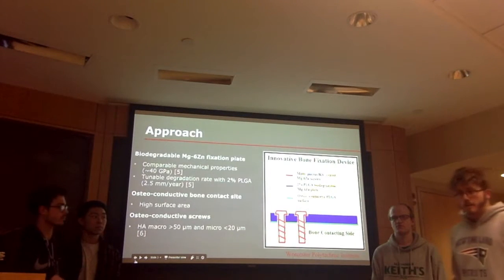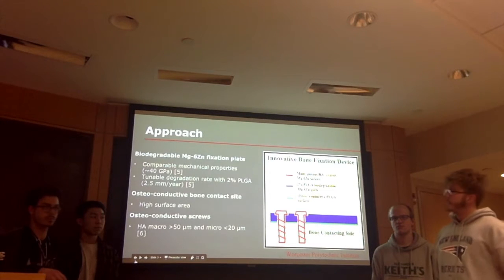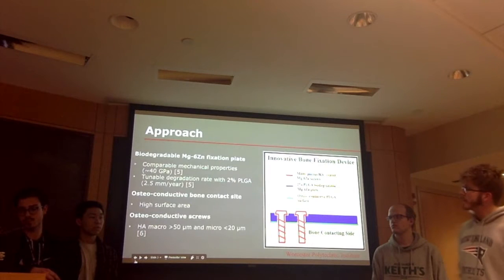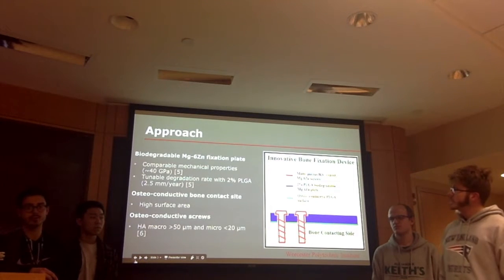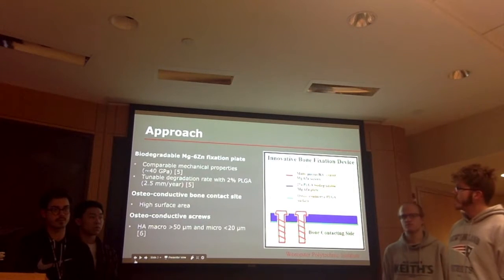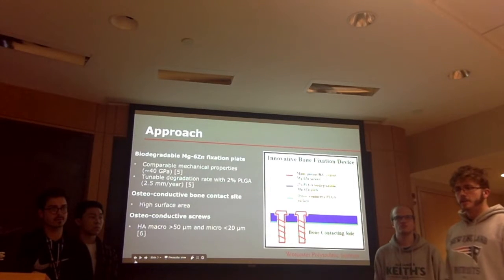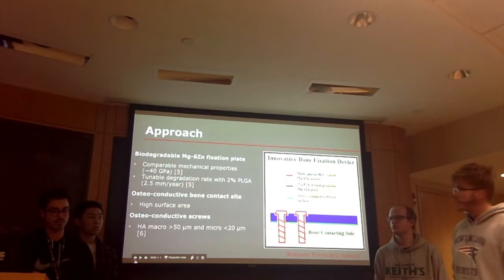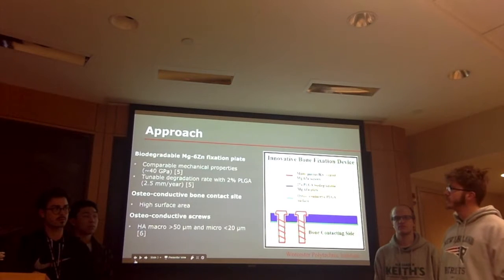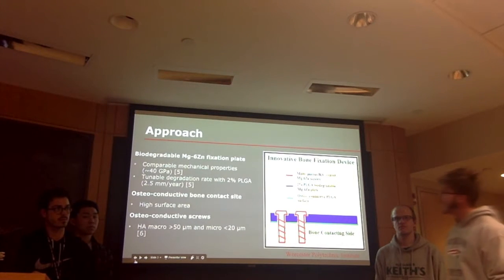As has been stated, our approach is to design an internal fixation plate that will degrade at a rate that allows for proper bone remodeling. We'll achieve this through the use of a biodegradable magnesium-6 zinc alloy, and our choice for this metal is due to its preferable mechanical properties, being similar to that of human bone. The Young's modulus of human bone is 20 gigapascals, and our metal is close to 40 gigapascals.